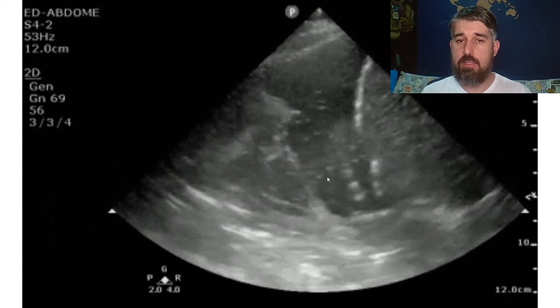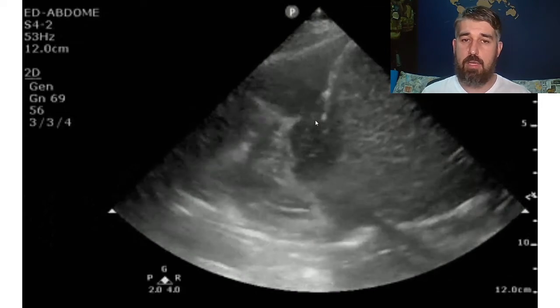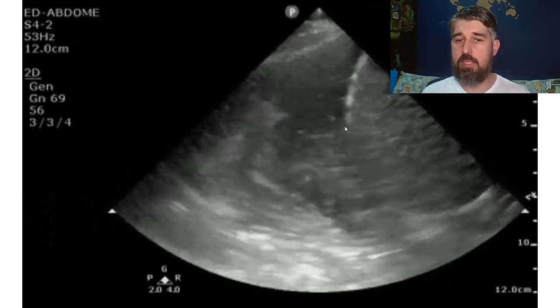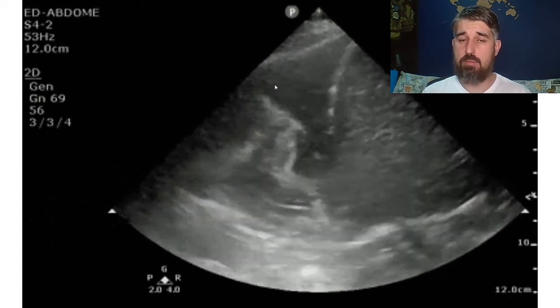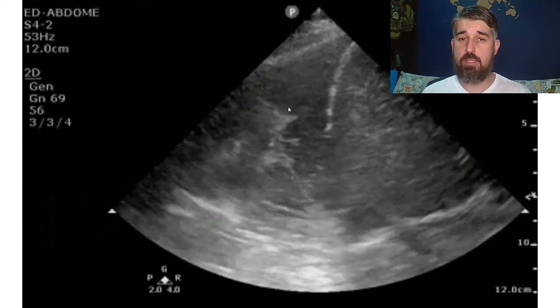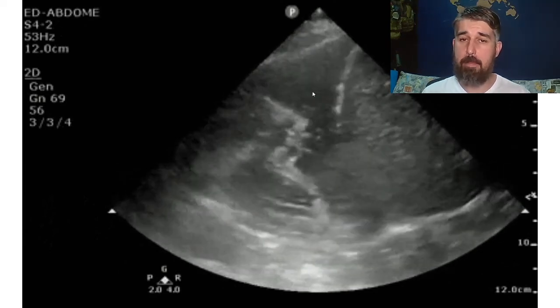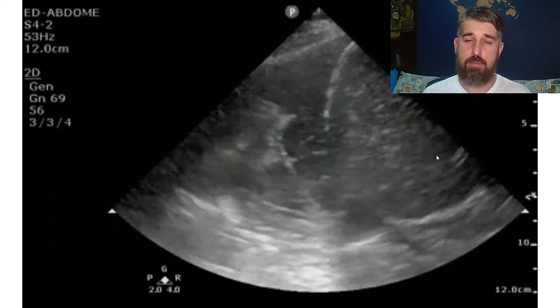Also, we can see these little white sparks. This tells us more, meaning probably this is blood. Sometimes these are clots, so the liquid here is not as homogeneous as before, but in this case we have blood, we have hemothorax.